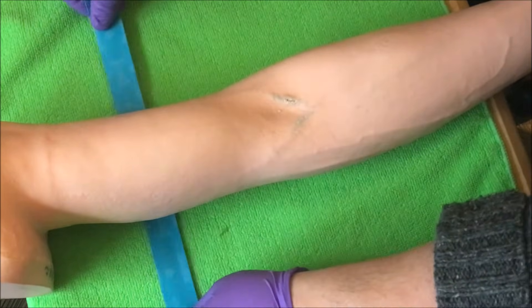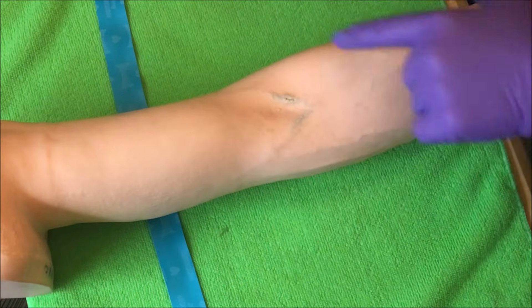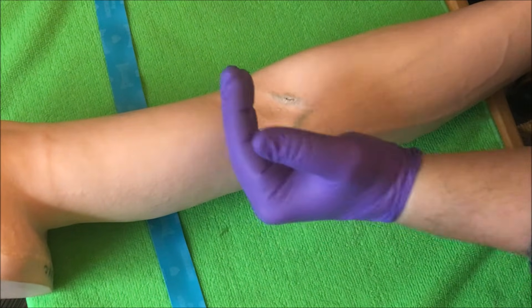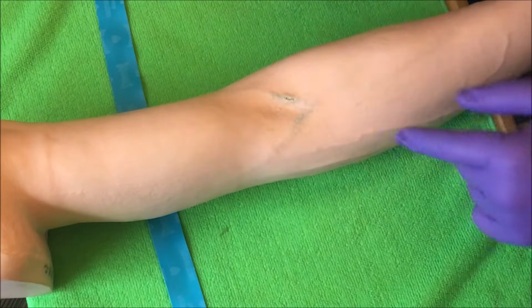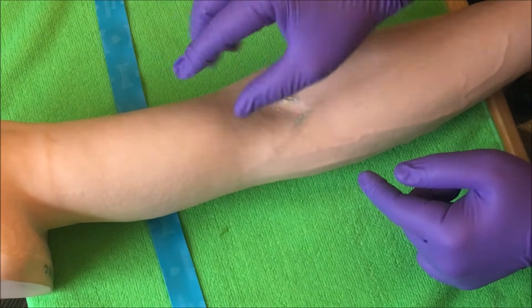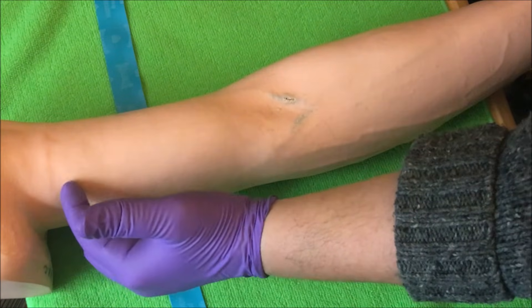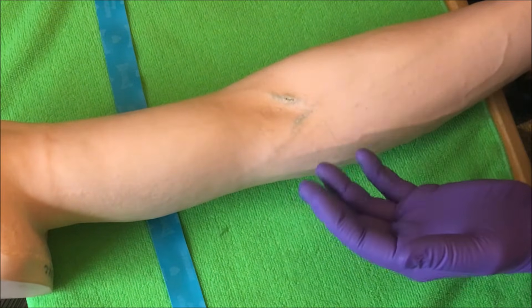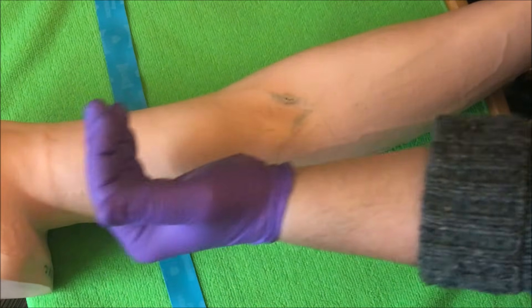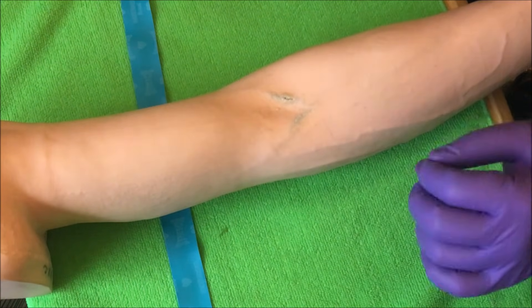Tying the tourniquet is important. The first thing to understand is that we always tie the tourniquet three to four inches above the site — the antecubital fossa, where all three veins are located. Three to four inches above the site is typically the midpoint of the bicep. We don't want to go too low, like one or two inches above the site, because the pressure could cause the vein to collapse and cause a hematoma. But we also don't want to go too high, toward the top of the bicep, as that may not effectively restrict blood flow. Three to four inches is the CLSI standard.